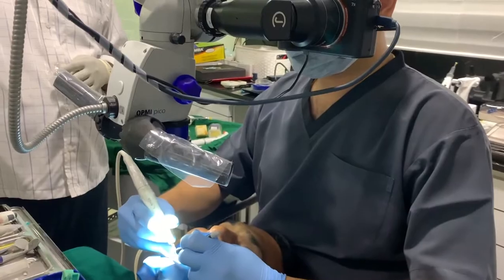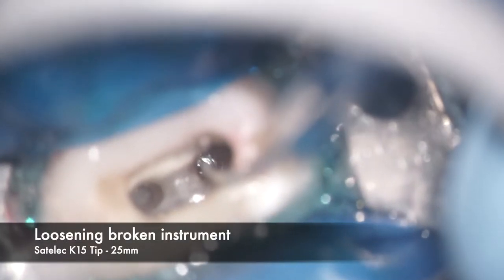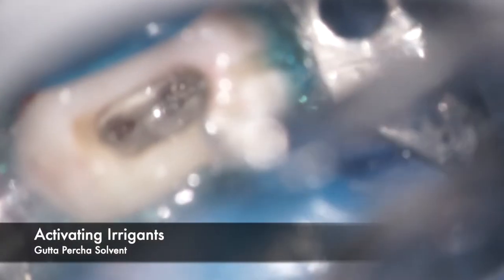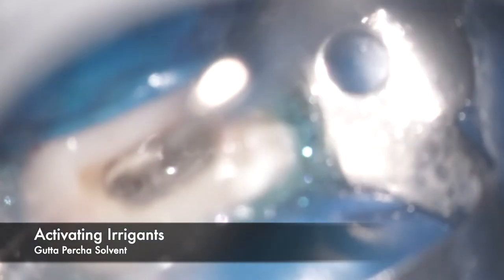Once I'm able to visualize the entire head of the instrument, we start to use a K-file type ultrasonic tip from Satelec used at a low to medium amplitude, trying to activate it along the inner curvature of the tooth. The instrument was in the buccal canal.